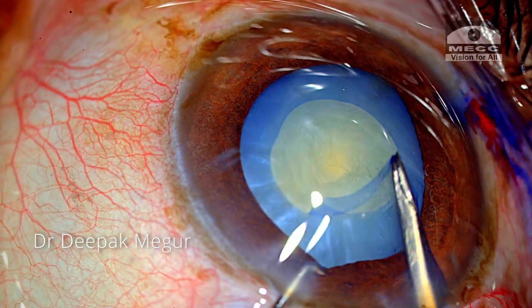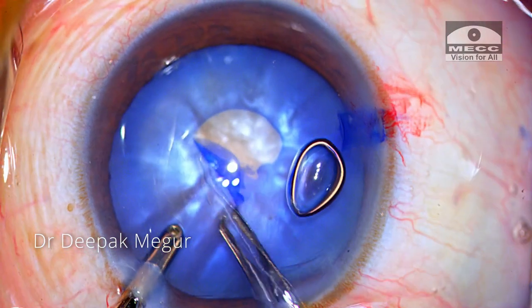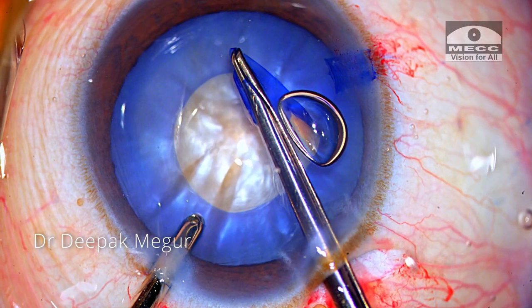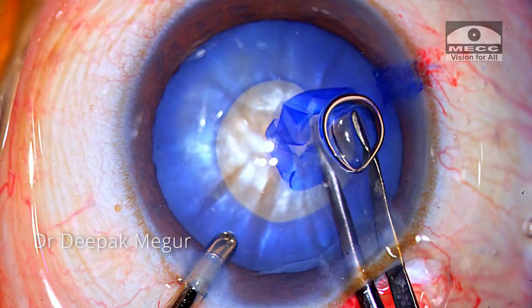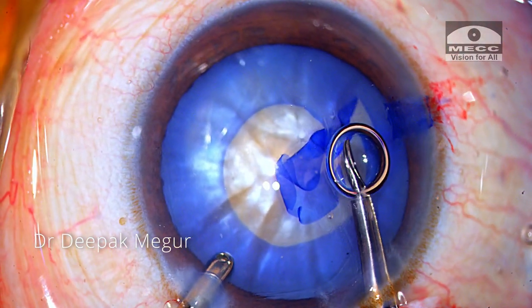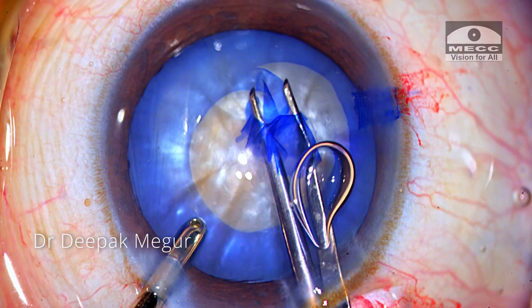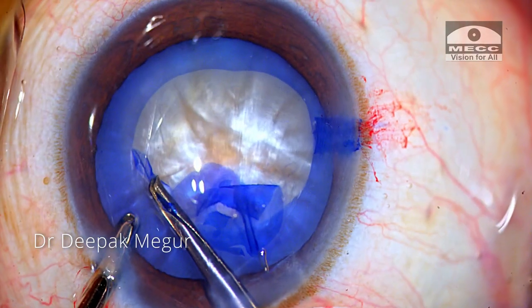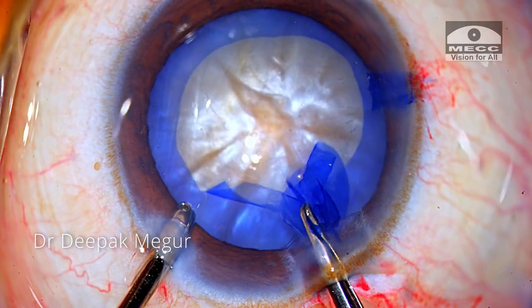Of course, this rhexis needs to be enlarged after decompression. In this case, I start off with the goal of a slightly bigger rhexis. It looks in control, but at this point I realize I don't have great control over the tear and it is at risk of running towards the equator. I stop, make the flap flat, and then pull it centripetally — timely intervention saved the rhexis from running away. Once it is reined in, the thin flap is everted and using the shearing technique, the flap is folded and in a controlled manner we achieve a bigger rhexis.